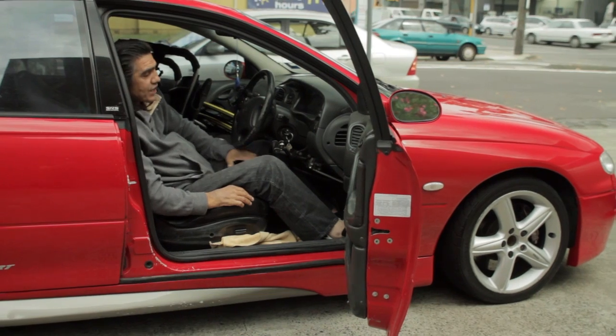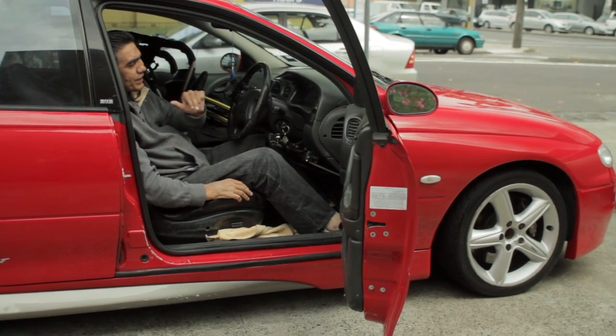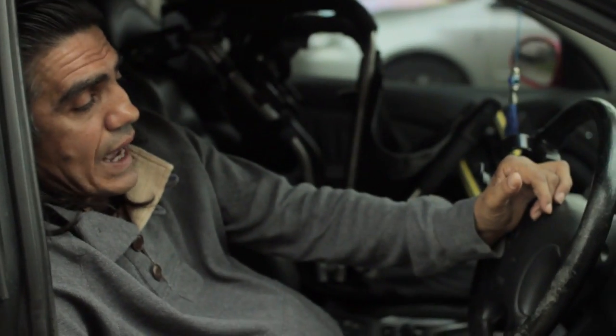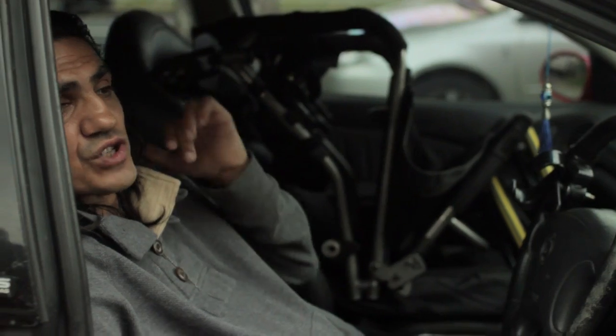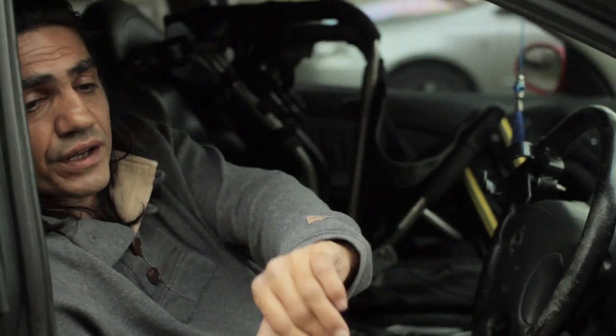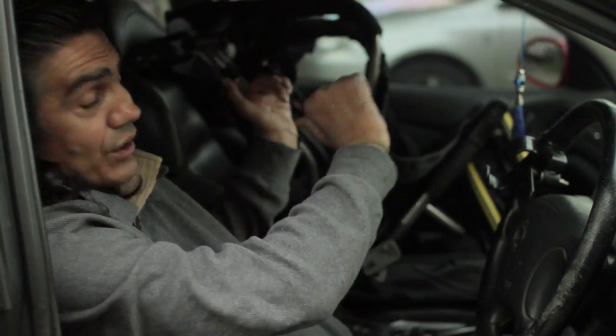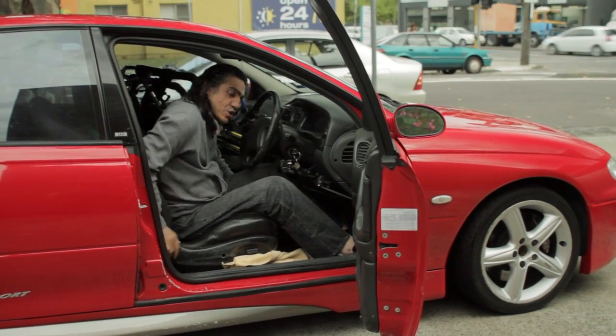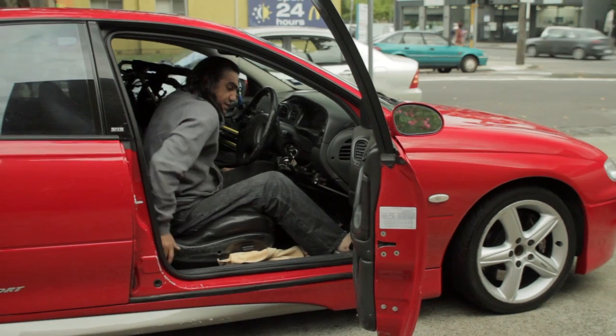And as you'll notice too, I've got this space in between the seat and the steering wheel. And the reason for that is because I'm leaning back, I know my body's not going to fall forward, and I can use both hands to get the wheelchair across and have that space there. So once I'm in, I just wind the seat back up into the driving position.